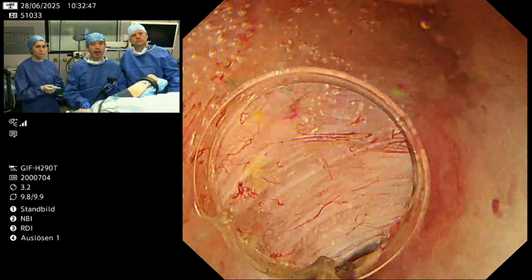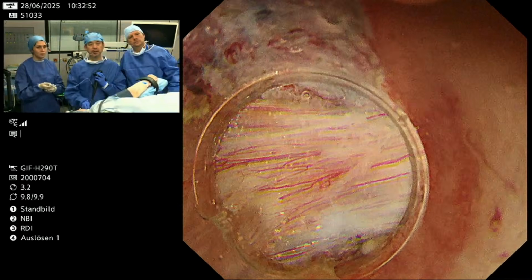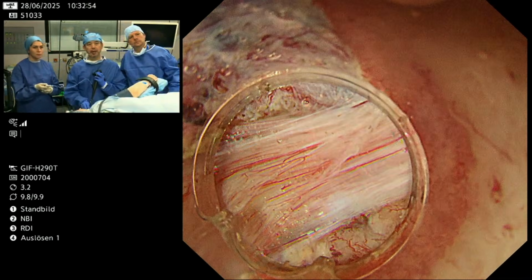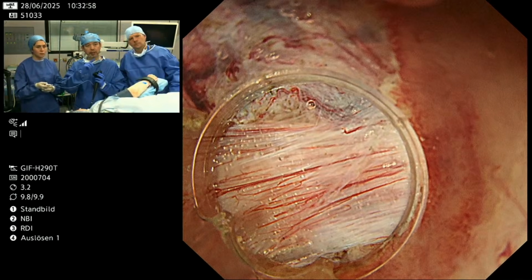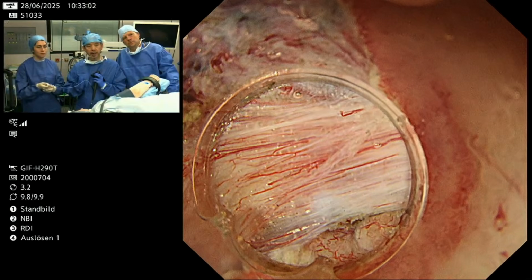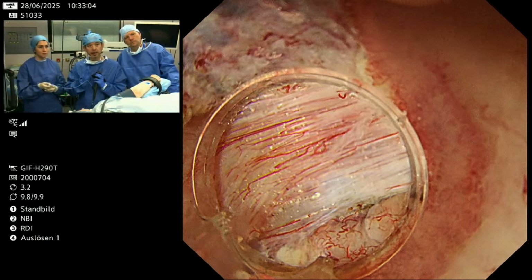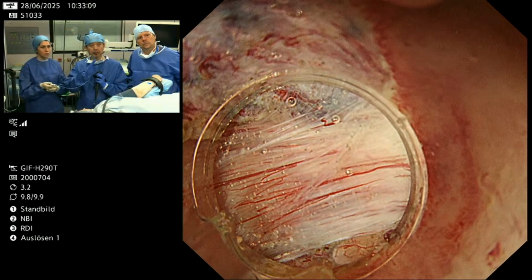But I found this really severe fibrosis at the central part of the lesion, probably due to the movement of the big polypoid lesion, which induced muscle traction and severe fibrosis. Now I'm going to cut through there, and if we are lucky, we can cut here without bleeding.